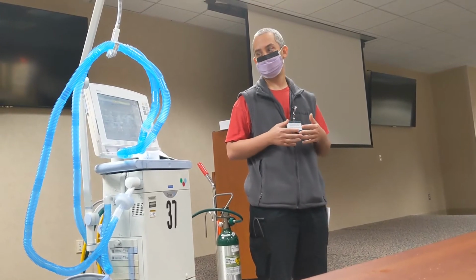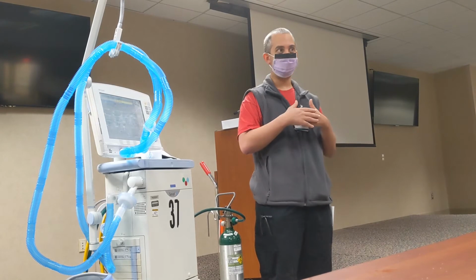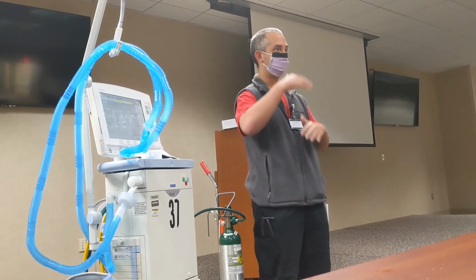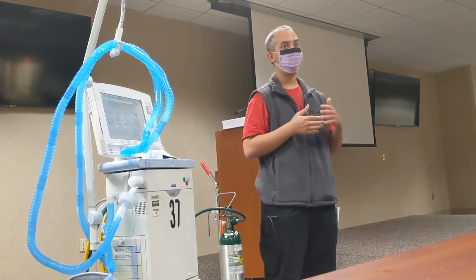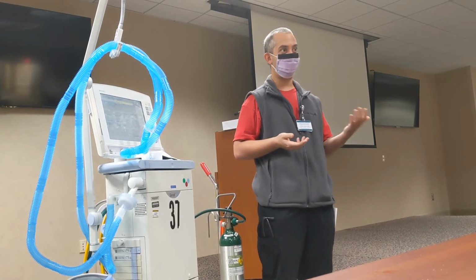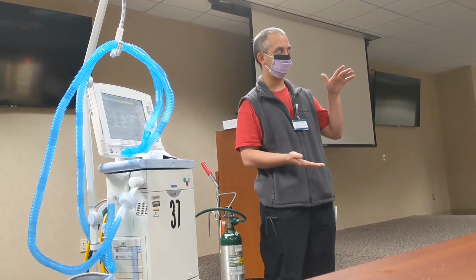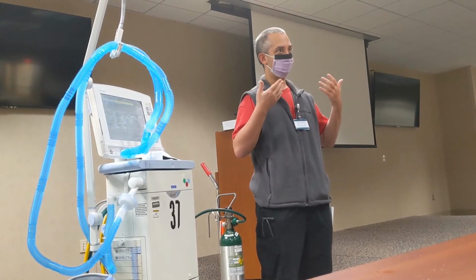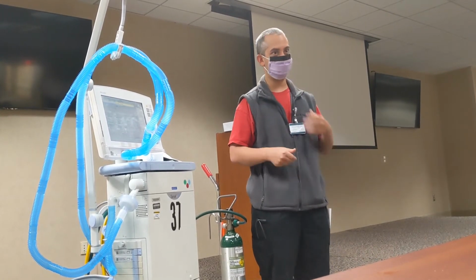And you also need to pay attention with that because your ventilation is based on your difference between P high and P low. In the same way, you change it with IPAP and EPAP on a BiPAP: you increase the distance between the two, you're going to get more volume in, leading to better ventilation and exhaling out.